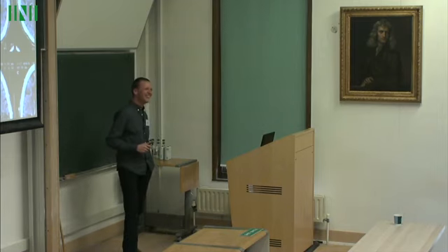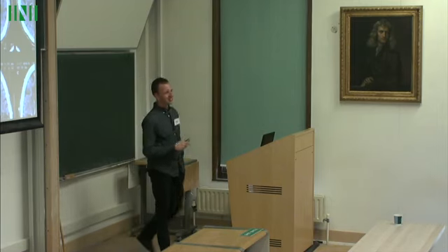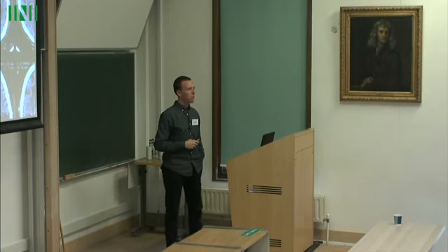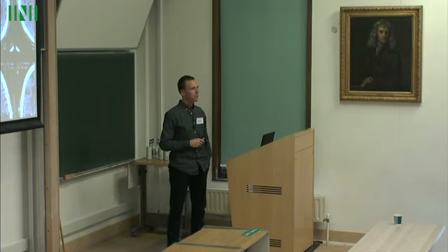No, actually, I've got quite a good answer for this. First of all, we work with image registration. One of the required DICOM header bits of information is voxel size, and we can measure the size of that voxel, or sorry, the movement of that voxel in millimeters. So we use an SI unit, and that actually quite nicely standardizes us across different platforms. You find there's quite low variation where we'd expect to see low variation, because we're basing it on size.